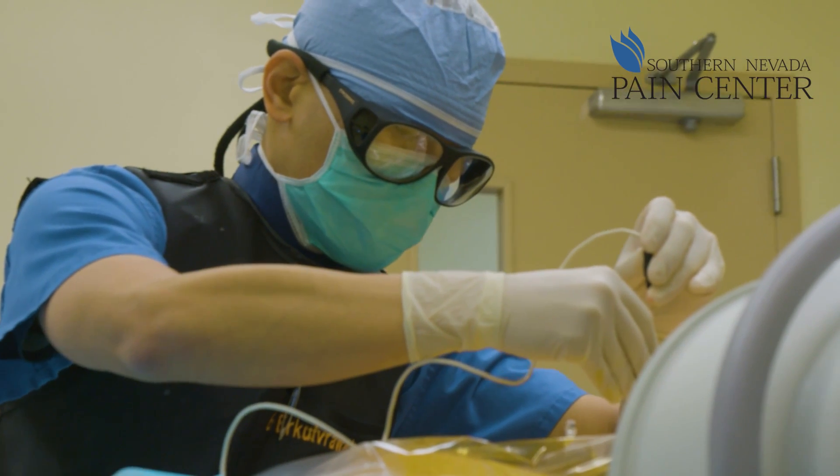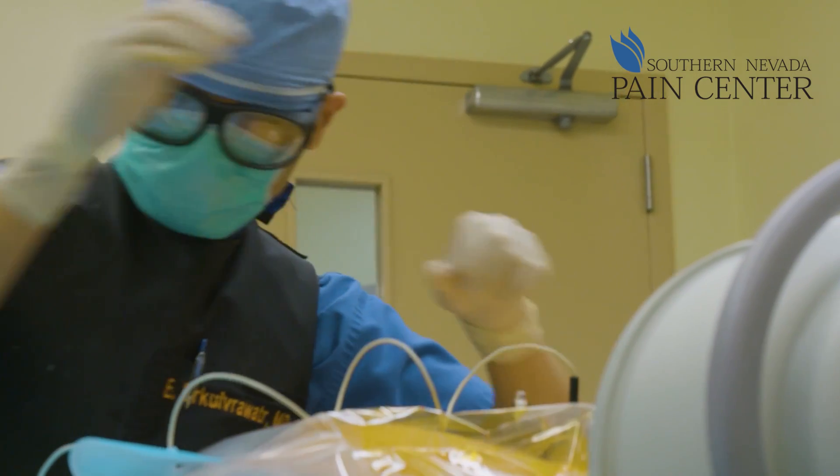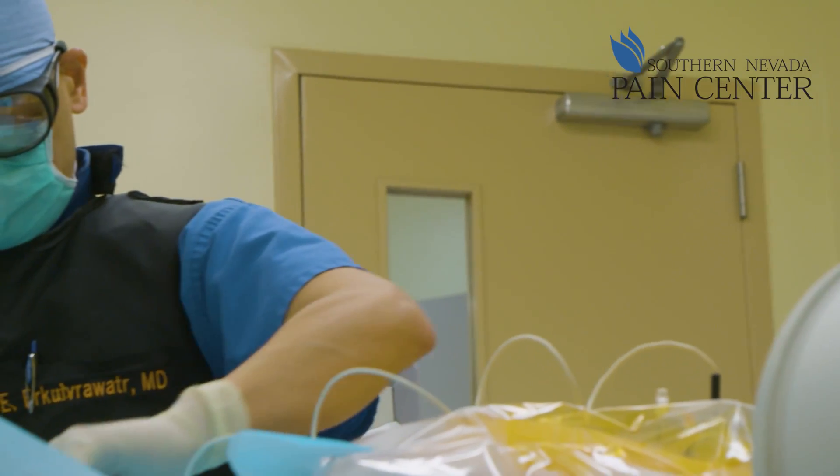Radiofrequency ablation — the term we often like to call it is nerve burning. It's essentially using thermal heat to burn or cauterize the nerve that innervates the joints of our spine. What we do is, if we can burn those nerves, we can essentially de-innervate or stop transmission of pain from that joint.